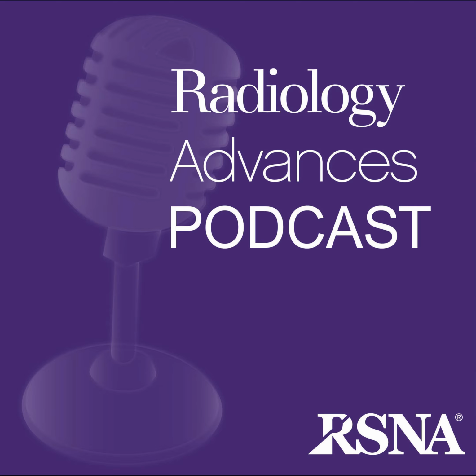It is. And the intra-class correlation coefficient, or ICC, was a strong 0.88. Compare that to trying to measure on a standard T1-weighted image, where you'd underestimate the volume by almost 30%. The synthetic contrast just works for this. So the tool is validated. It's accurate, reliable, non-invasive. What did they find when they applied it?